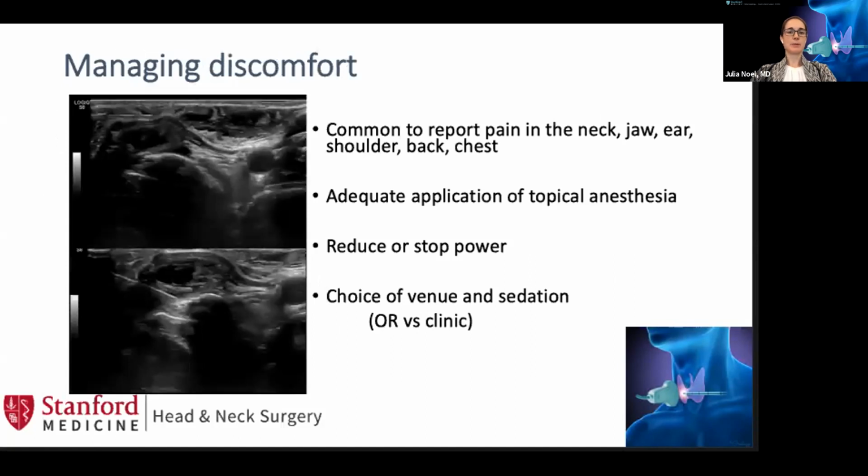Pain is the most common reported side effect during the procedure. It's generally not significant and is very temporary, but you shouldn't be surprised to hear patients reporting discomfort not only in the neck, but sometimes in the jaw or teeth, the ear, the shoulder, back or chest. And fortunately, this can be almost eliminated by the adequate application of topical anesthesia, after which patients tolerate the procedure quite well.